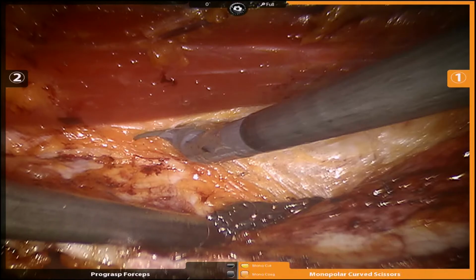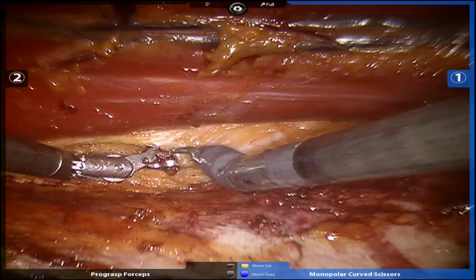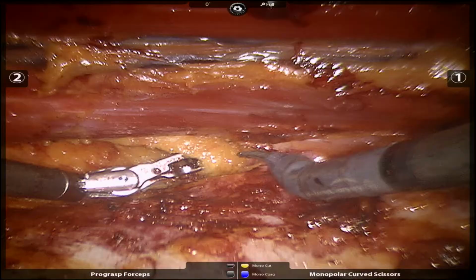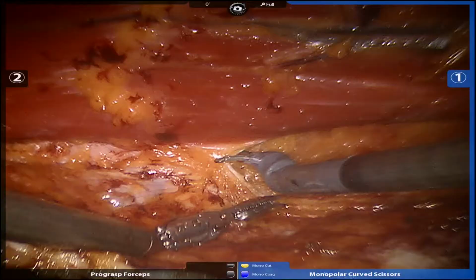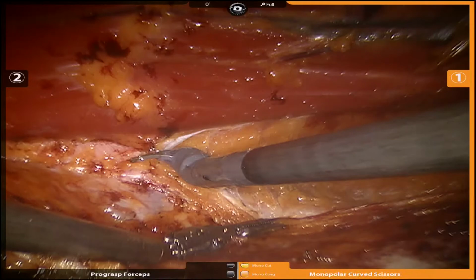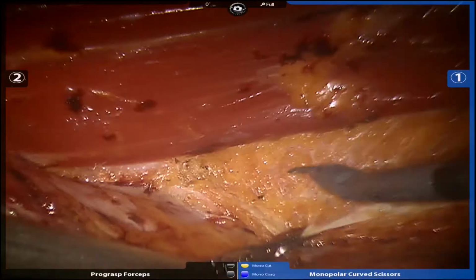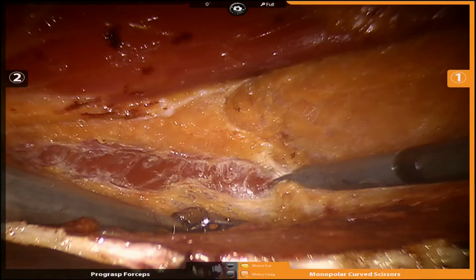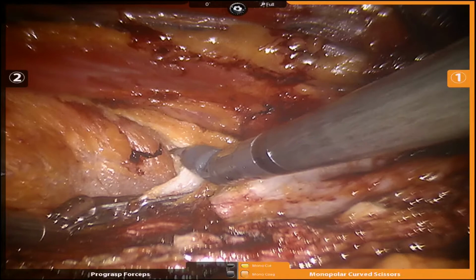The linea semilunaris is incised, and an interparietal plane in between the internal oblique above and the transversus abdominis below is entered. Continuing along this plane allows for excellent posterior mobilization of the posterior sheath, as well as freeing up of the anterior fascia above for subsequent closure of these two layers.